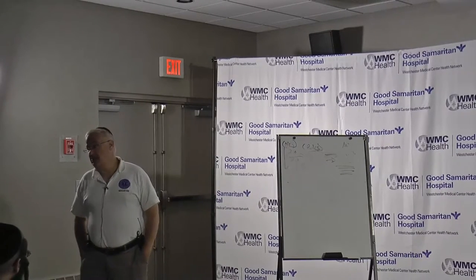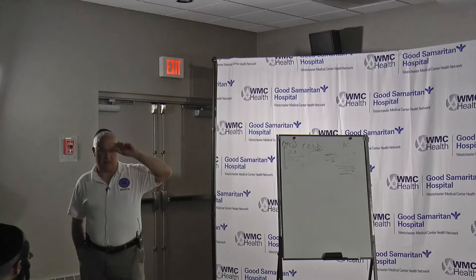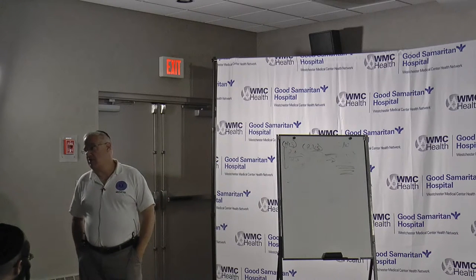You could have what they call demand pacemakers. It'll only fire if the rate goes below a certain rate. And you've got pacemakers that are on all the time. If somebody had a demand pacemaker and their heart rate was 80, maybe their pacemaker's not firing. It would only come on if they're bradycardic. But let's say this is one that's on all the time. If the heart rate's irregular, then there's some problem that the pacer is not firing on a regular basis, because you should not have an irregular heartbeat. The only time they may have a paced rhythm with an irregular heartbeat is if they're having some premature beats, some PVCs or something like that. They could have a slightly irregular beat if those PVCs are actually conducting.